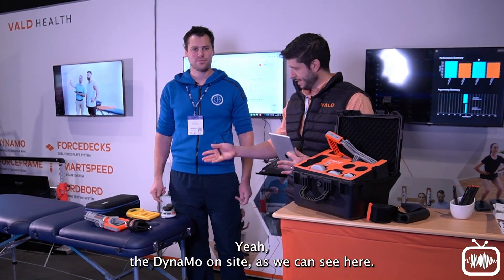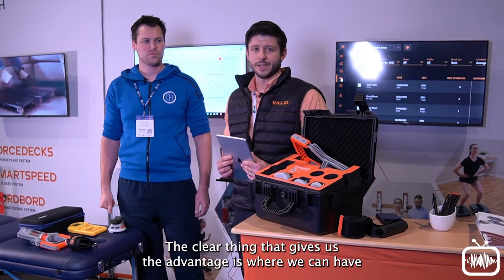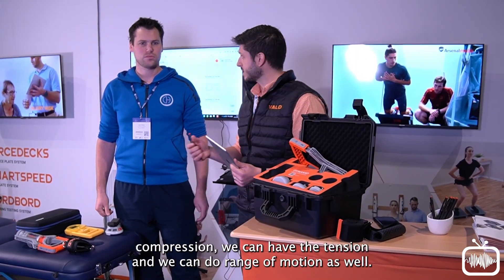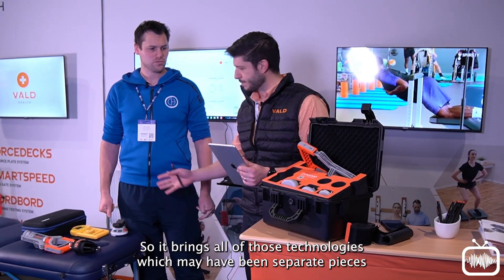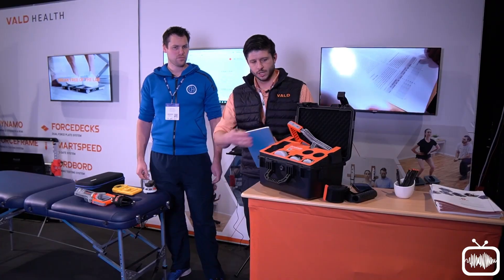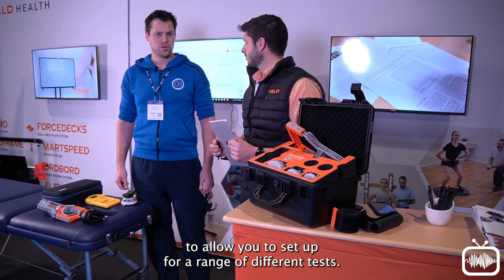The Dynamo on site — the clear thing that gives us the advantage is where we can have compression, we can have tension, and we can do range of motion as well. So it brings all of those technologies, which may have been separate pieces previously, and brings those together into one package with a range of different attachments to allow you to set up for a range of different tests.